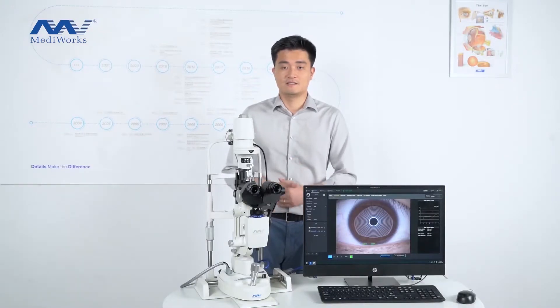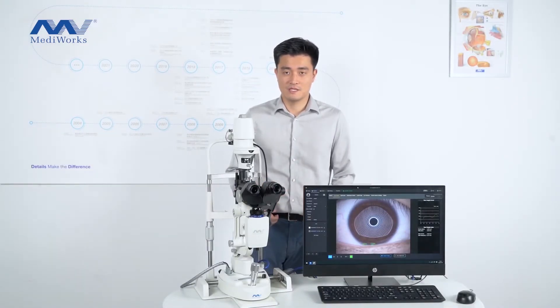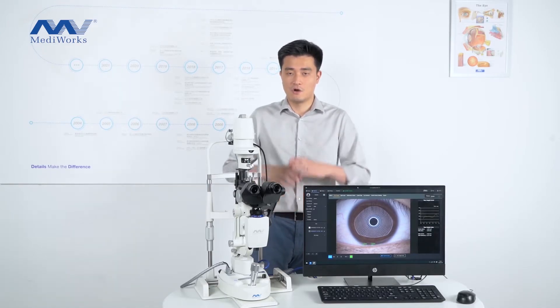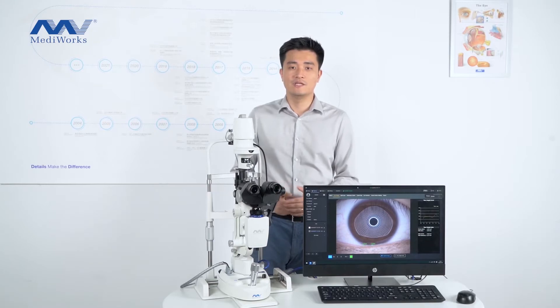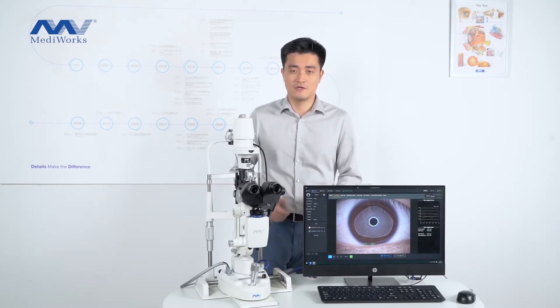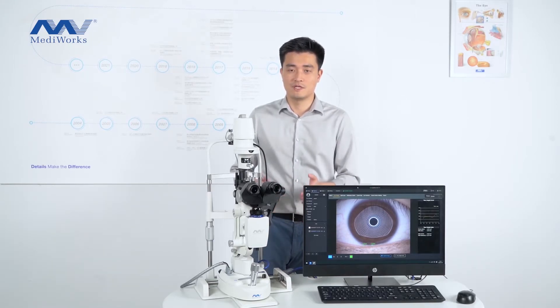This is the dry module. It can be assembled on our Firefly slit lamp easily. This means you can purchase the whole dry system altogether, or you buy the digital slit lamp first and when you need to add the dry functions, you purchase the dry module in the future.